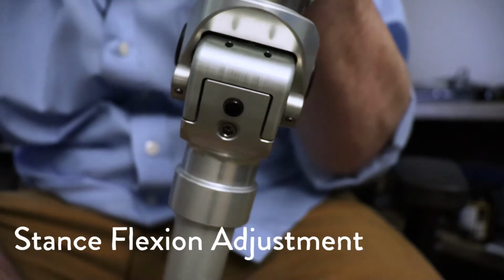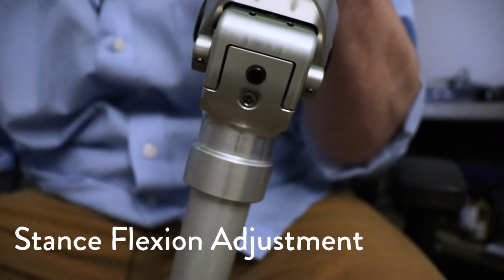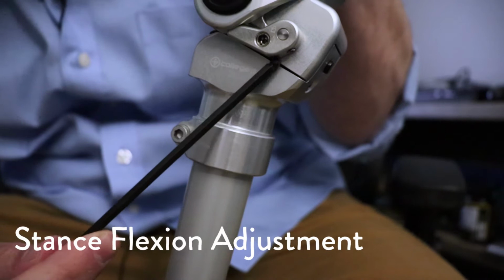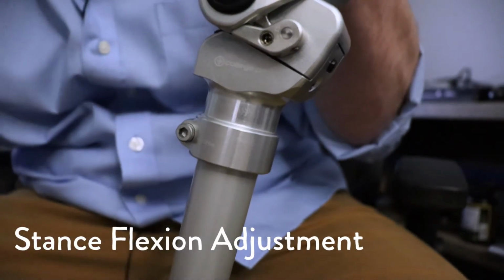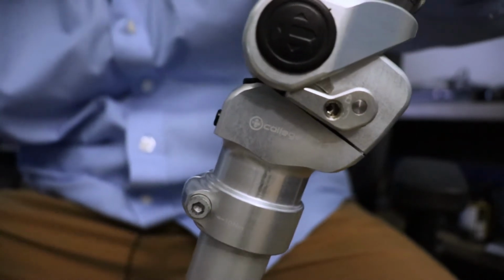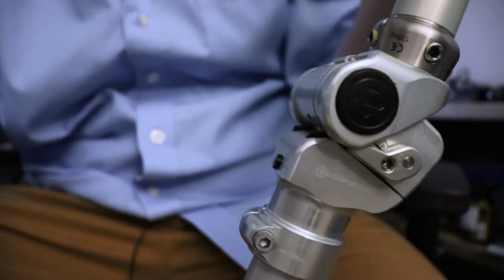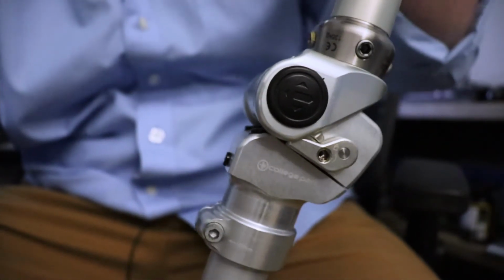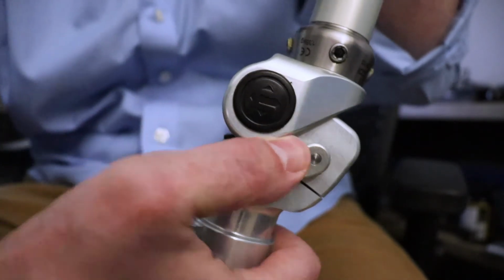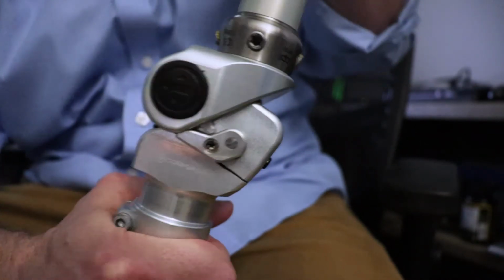Okay, now on the front is our stance flexion adjustment. Stance flexion is this gap right here. So that's sort of like a shock absorber for the knee. I don't know if you'll be able to see this, but there's about 4 degrees of this shock absorption, this stance flexion. Now I've got stance flexion maxed out. I've got the most stance flexion I can have, and I have this knee in locking mode. And now you can see when I push weight on the toe, it unlocks pretty easily there.